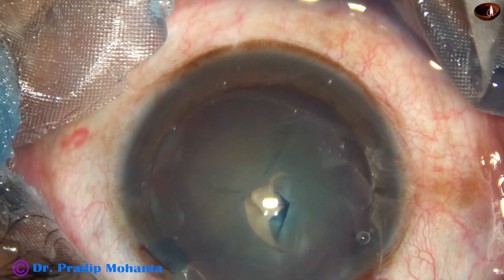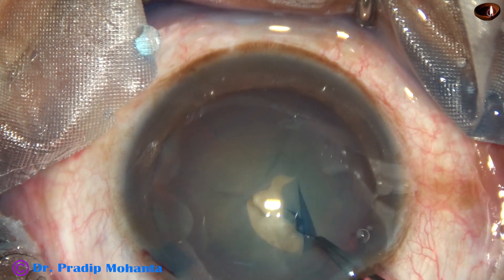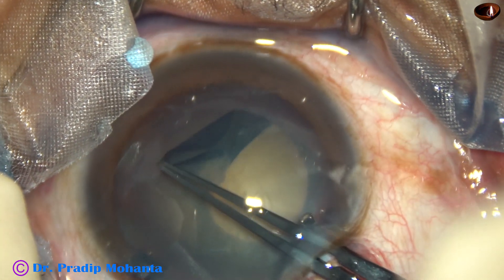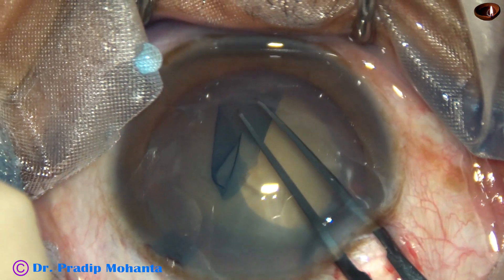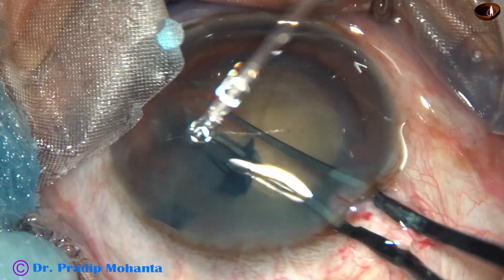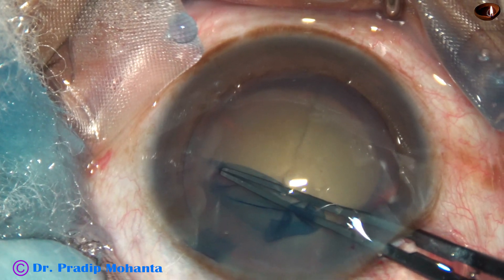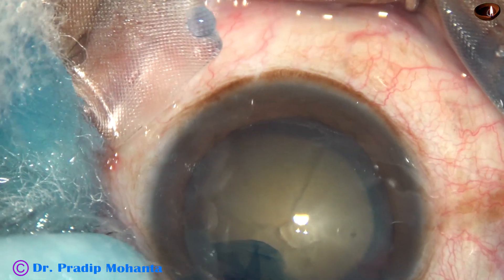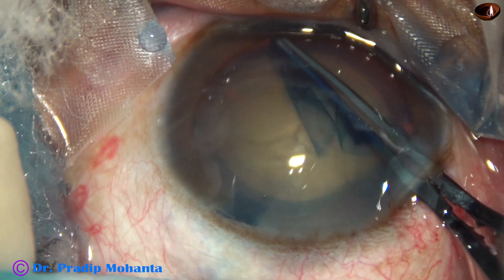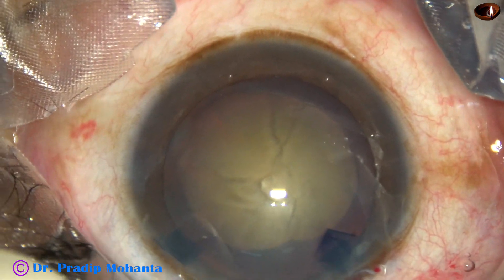The anterior capsule has been incised and the anterior capsular tag has been raised. I hold this tag with the utrata forceps, go anticlockwise, remaining at a certain distance away from the margin of the dilated pupil. Try to do a large rhexis because the cataract is about grade 4, quite hard. In hard cataracts, never do small rhexes.